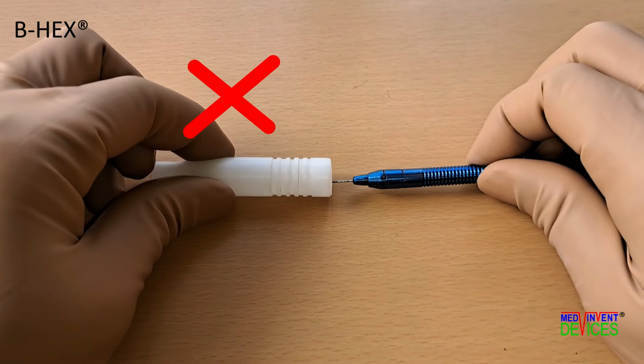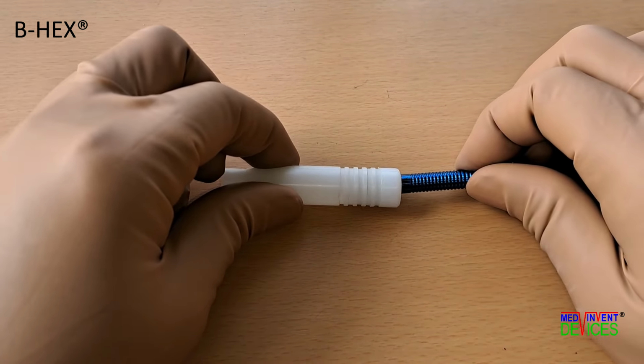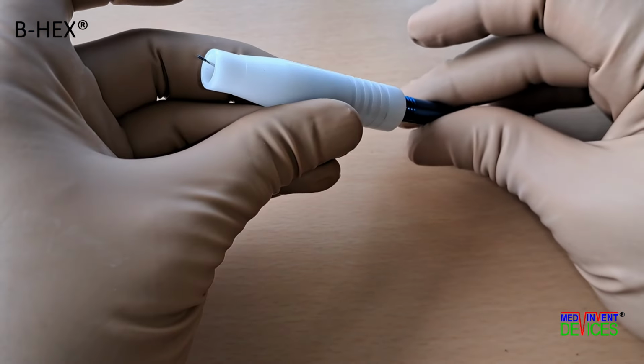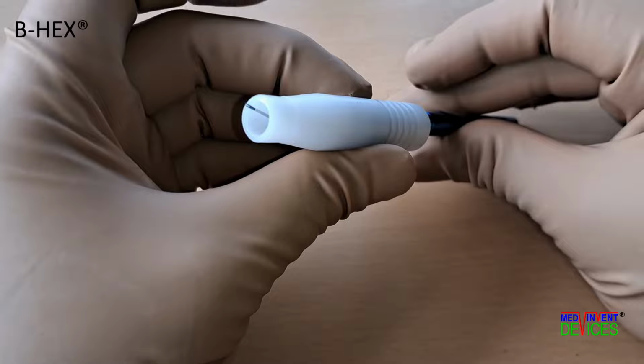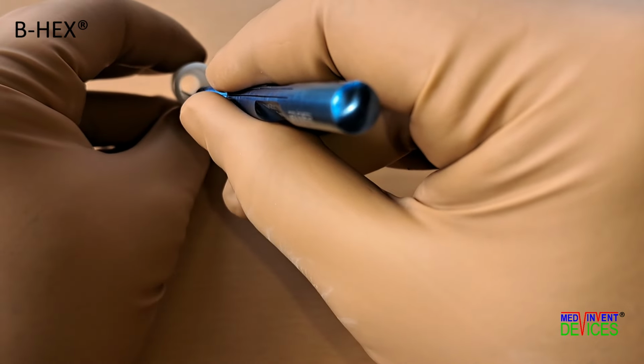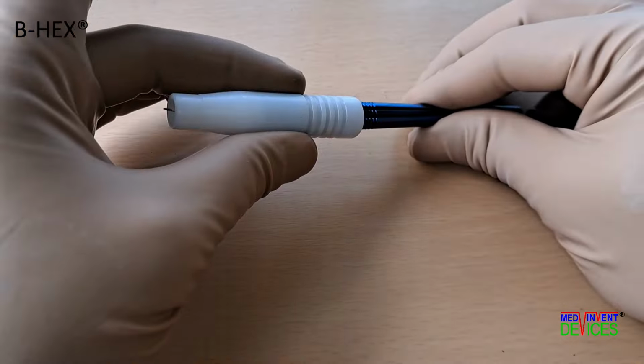Never slide the wider end of the cap first. The cap remains loose-fitting, and the forceps will slip through, leaving the jaws exposed. There is also a chance of the jaws hitting the internal stop of the cap.